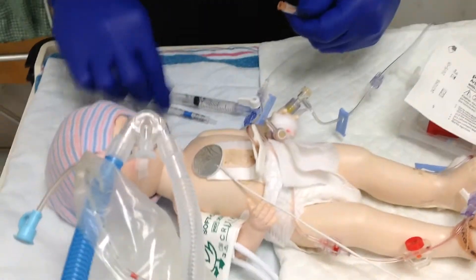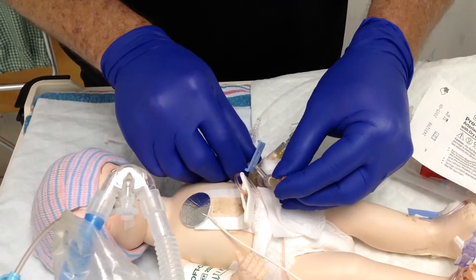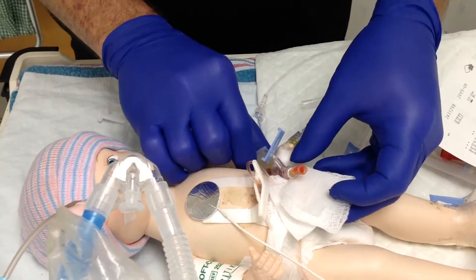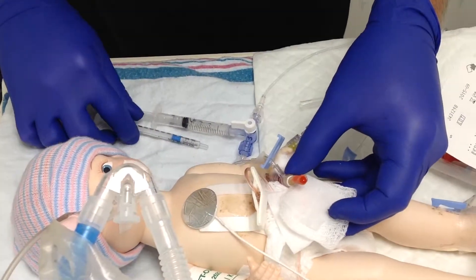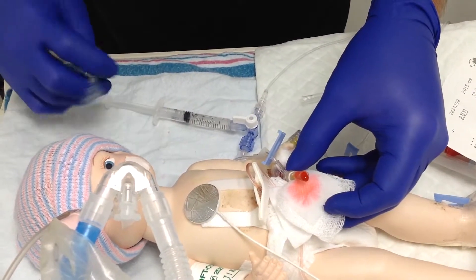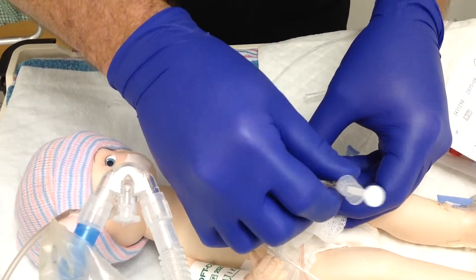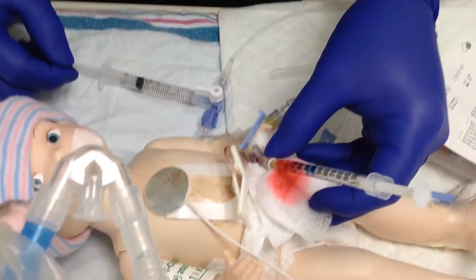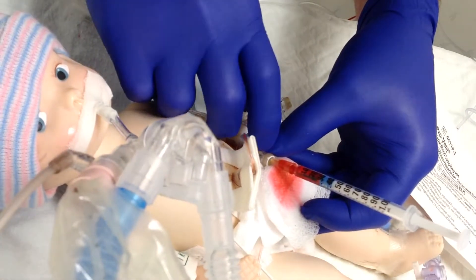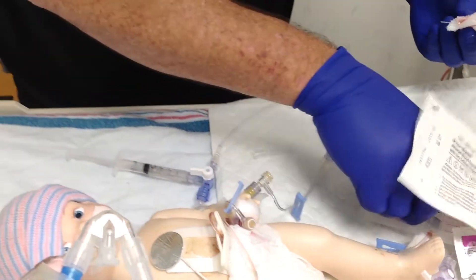Carefully remove your needle from the end of the syringe. Pull the cap off and insert it into the hub and let it drip 5 drops. Replace your needle onto the end of the syringe and let it fill to 0.3. Ask your nurse if she needs a D-stick. Remove your needle carefully and replace it into your safety device.